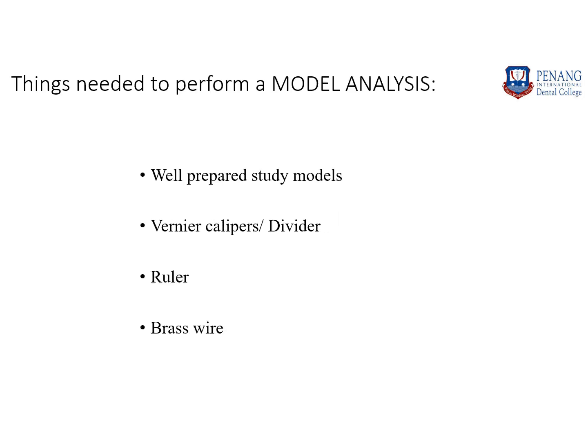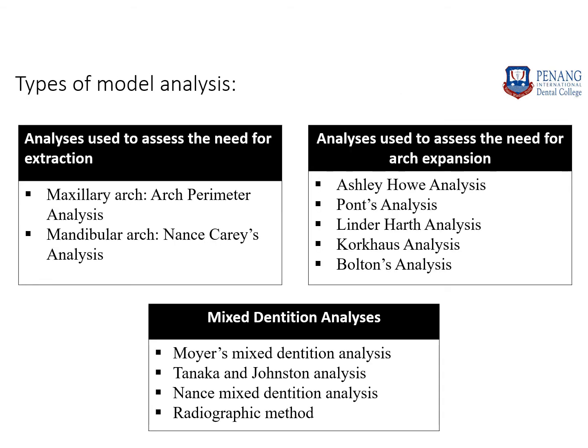So for performing a model analysis, you will require well-prepared study models, vernier calipers or a divider, a ruler, and some brass wire. So what are the different types of model analysis?